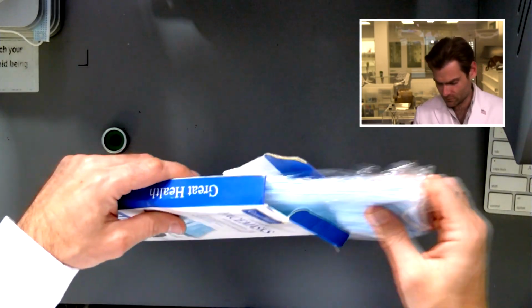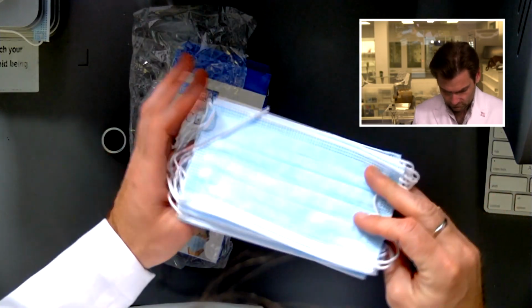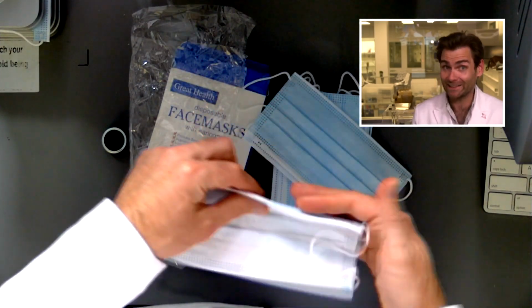That was weird. Did you see stuff come out? How old are these? 1800. There's like broken mask pieces in the packaging. That does not bode well. Let's try this. That's pretty good, but the ear loops are just huge, honestly.